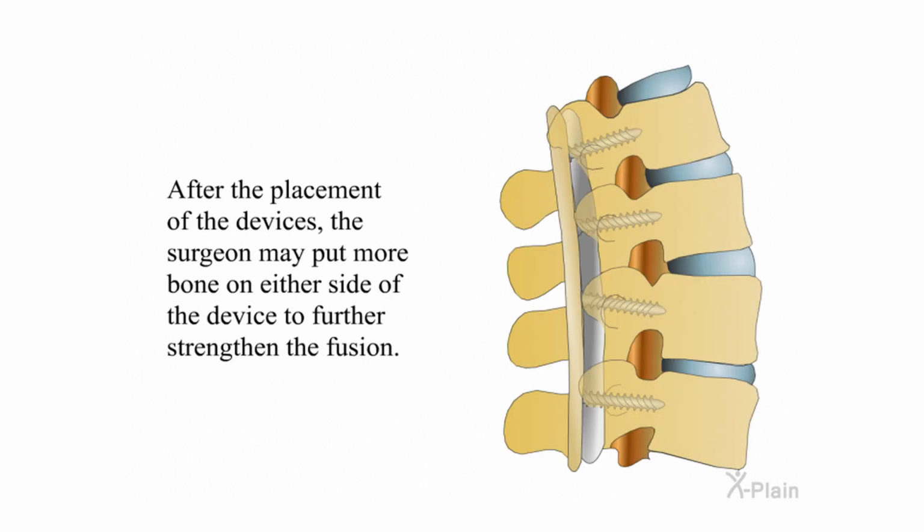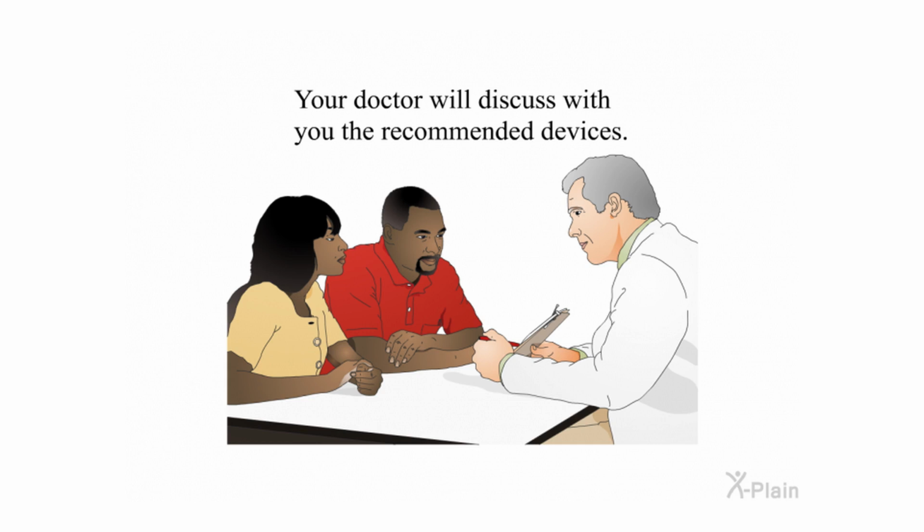After the placement of the devices, the surgeon may put more bone on either side of the device to further strengthen the fusion. Your doctor will discuss with you the recommended devices.